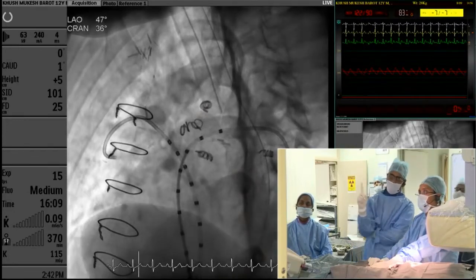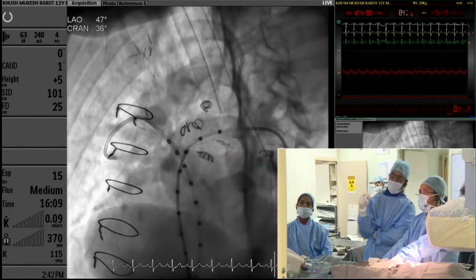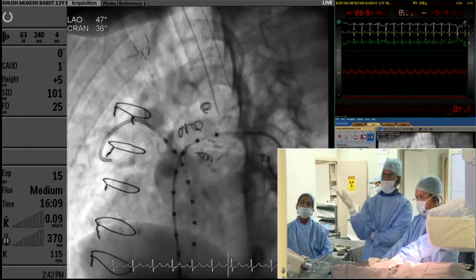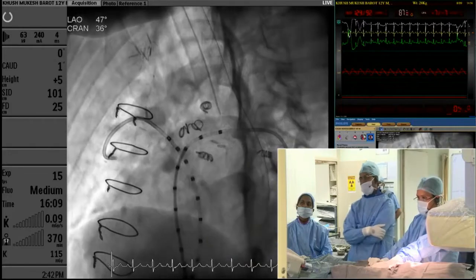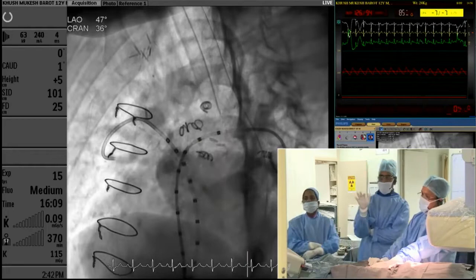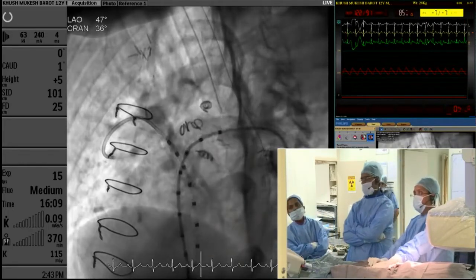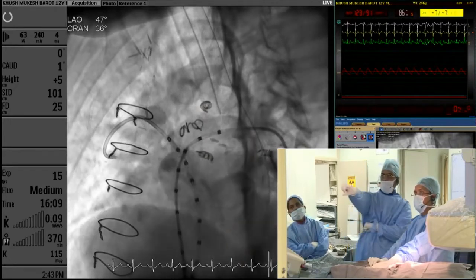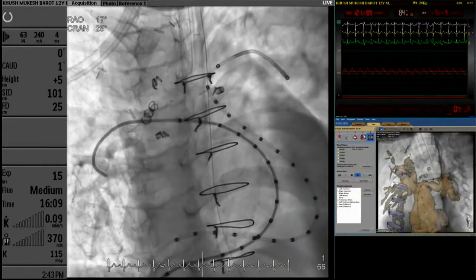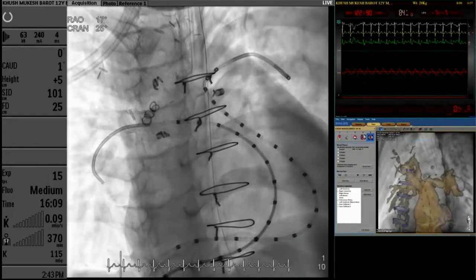This LPA stenosis happened after the last surgery where the surgeon extended the pericardial patch into the LPA origin. You can see the two clips at the lower end of the LPA pericardial patch. So this LPA origin stenosis and the mid-level stenosis are all recent. RPA was the previous picture. This RPA was narrow from the beginning. It's partially Gore-Tex. The undersurface is Gore-Tex, and the superior surface is bovine pericardium.